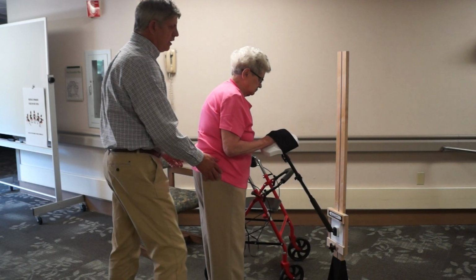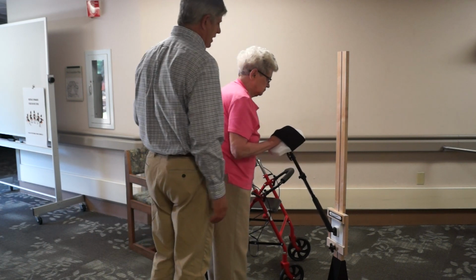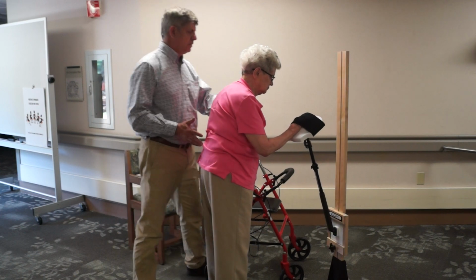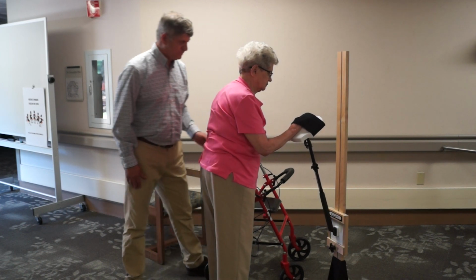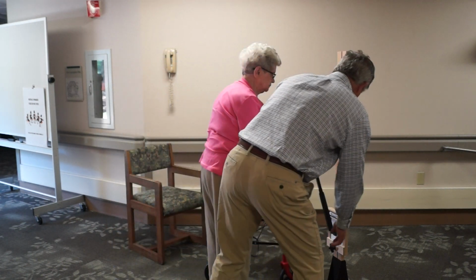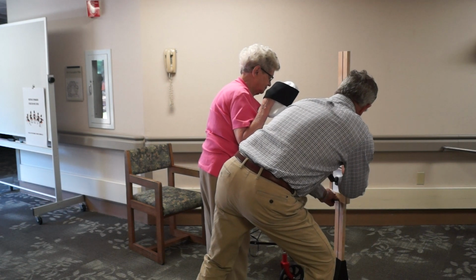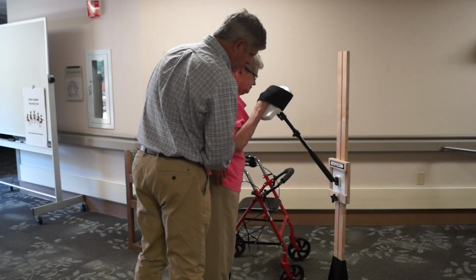Okay, perfect. All right, Audrey, now just reach forward and just keep a little pressure towards that, okay? By you having pressure against you, it's making your shoulders work, your shoulder muscles work differently. So just have you stand a little taller. How's that feel? Fine. I'm going to bring it up a little higher for you, okay? Now, let me ask you to step back a step. Okay, one more step with your left foot.